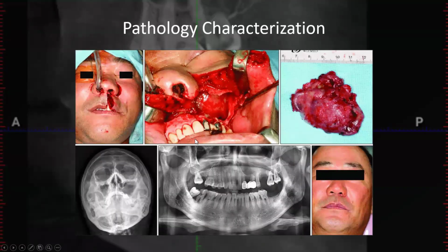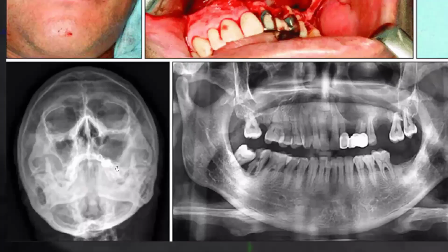All right, and this is where the oral radiologists specialize, in pathology characterization, telling you what a lesion might be. In this case, in this panoramic radiograph, the sinus just looks strange. Maybe I can blow that up. We have our Waters view. Looks like there's some tissue within both sinuses, but this one looks enlarged, and it looks like something is encroaching into the nasal cavity.